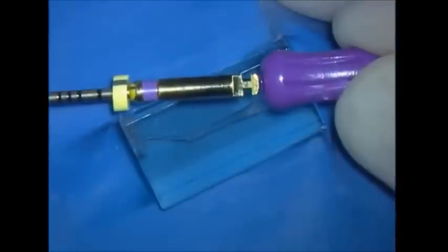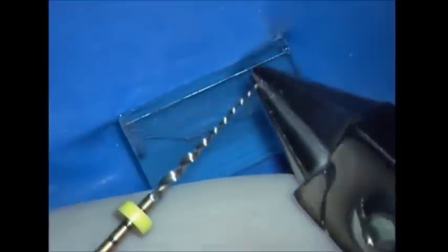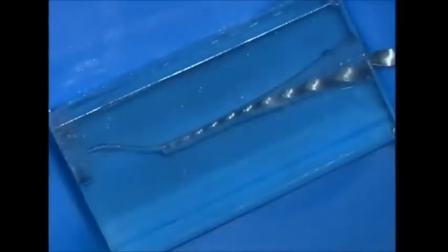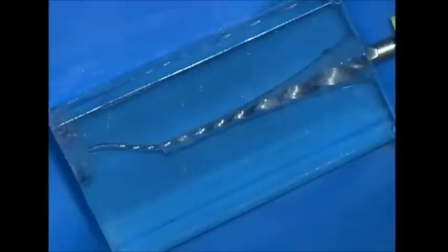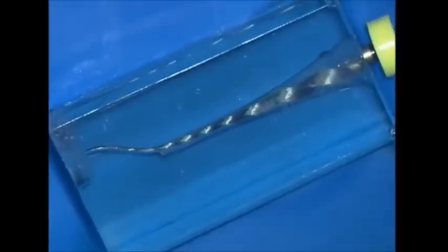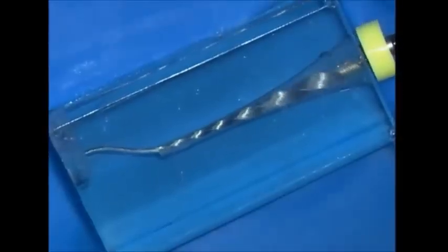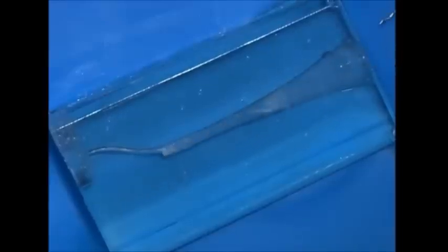The Shaper 1 is converted from a rotary instrument to a manual instrument, and again its apical extent is pre-curved. The pre-curved instrument can easily move through the pre-enlarged canal, and its terminal extent can be moved past the ledge, and the instrument is rotated, or you can use a reciprocating handle motion until the instrument achieves length. The next sequential instrument would be the ProTaper Shaper number 2.